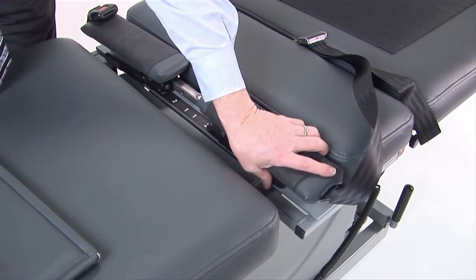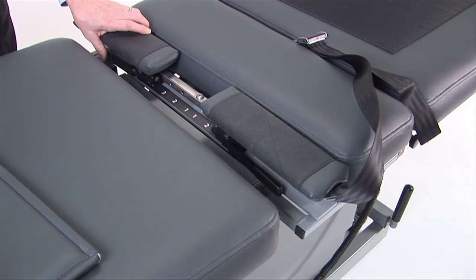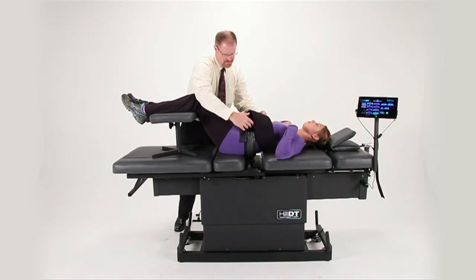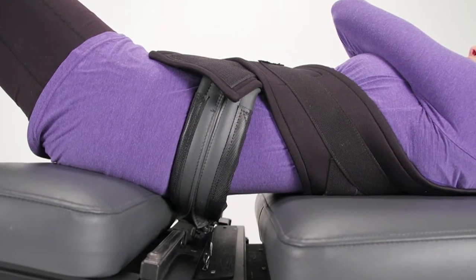Our signature pelvic capture features total encapsulation of the iliac crest with the ability to widen for all body types. The thoracic capture gently secures the torso, creating a comfort level unmatched by any other decompression experience.